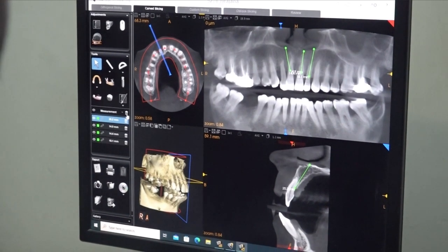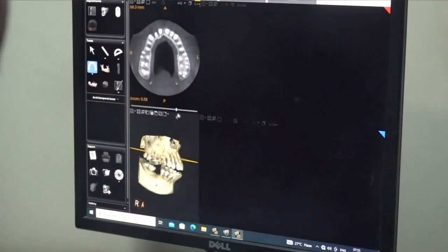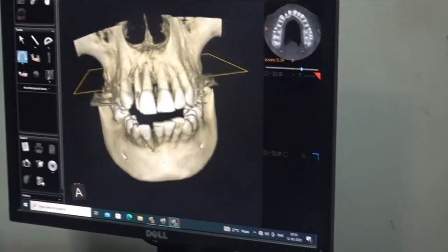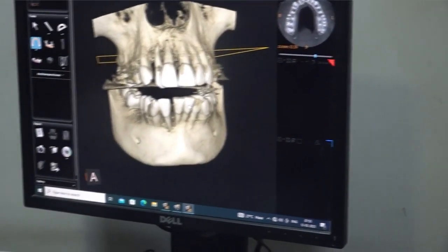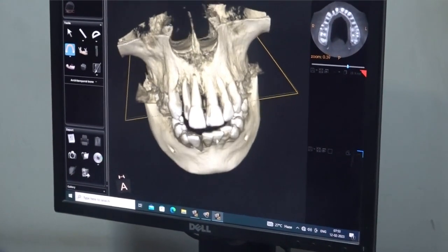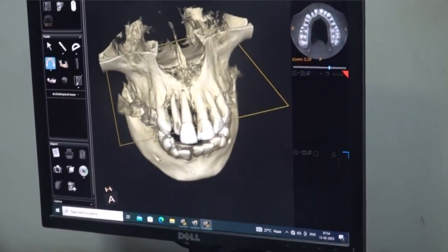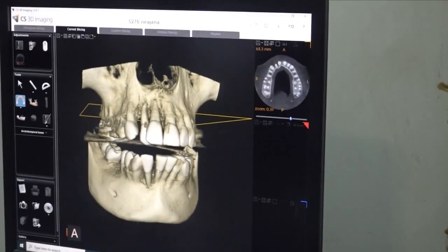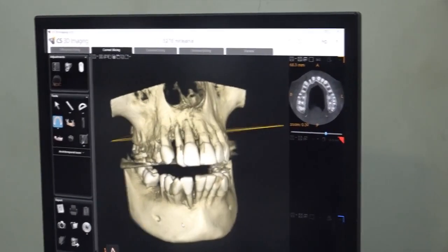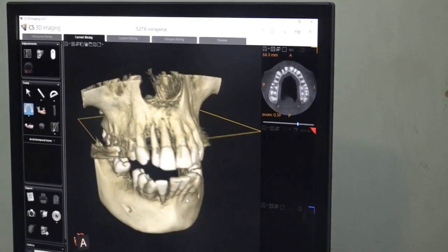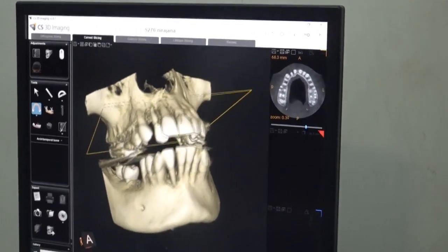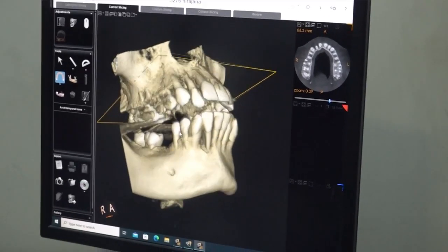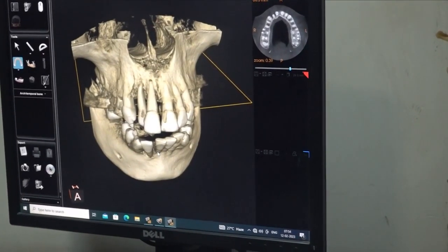Now we will come to planning the lowers. Whenever you are placing lower anteriors, check the 3D view first. Even though you are removing 6 teeth, that doesn't mean you can place 6 implants. One reason is crowding, and another is that the lower incisors are very small — the roots are very close. You cannot place 5 implants; 4 implants is a decent number, which we can determine from this 3D view.